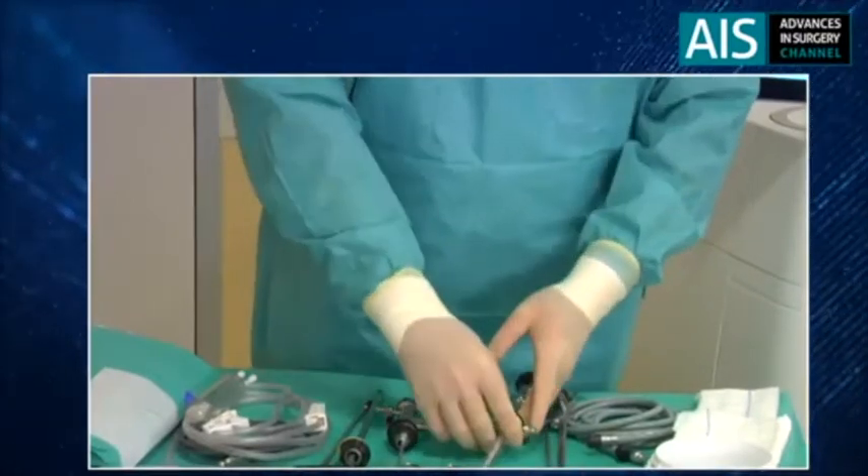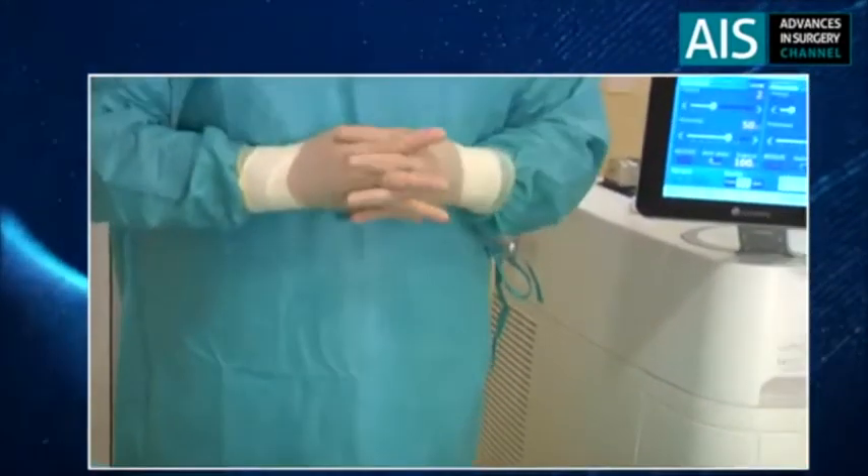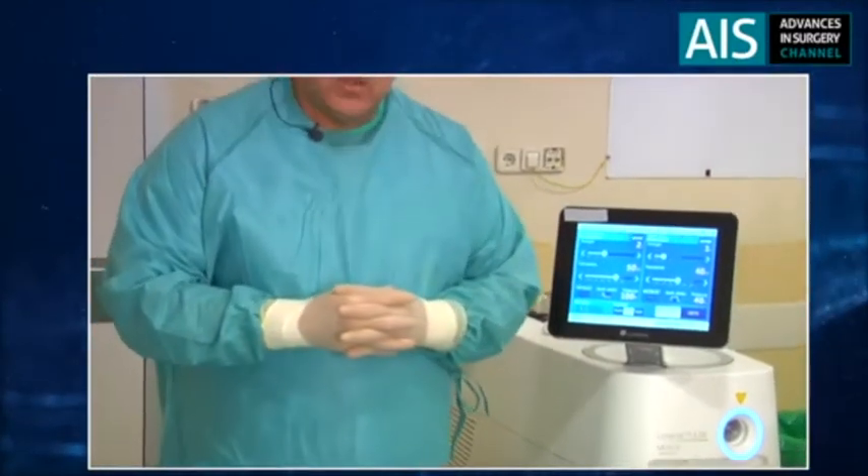We're going to use the new 120-watt console from Luminis and we're going to use the MOSES technology. It's a very interesting pulse modulation: instead of having a pulse laser that uses one single pulse each time, it coordinates two pulses — an initial one that generates a bubble and a second pulse that travels through this bubble to take the energy a little bit further. This in my opinion provides better cutting, which is paramount for this approach, and provides better hemostasis as well. I hope you enjoy the procedure. If you want to ask any questions you can do it through the website and I will try to respond the best I can.